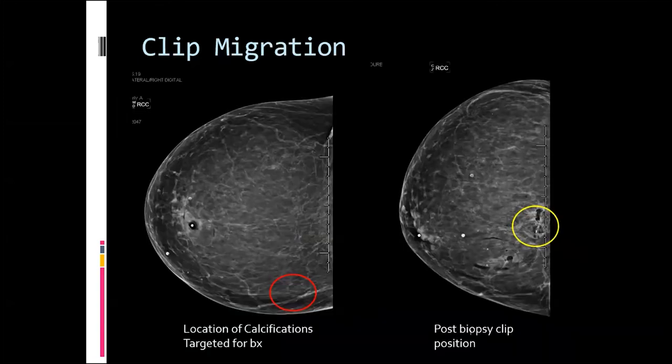Another issue to discuss now is clip migration, which can occur after biopsy. Here's a good example: a patient had a biopsy of calcifications in the medial breast, and after we put the clip in, we see the biopsy changes in the medial breast, but the clip has migrated laterally. You always want to hope there are some residual calcifications, so that in the event the result is malignant and needs to be excised, you can localize the calcifications and not worry about the clip.